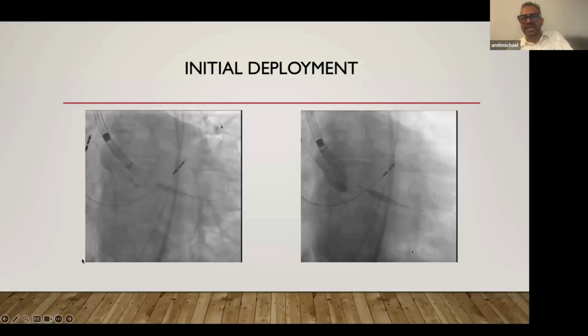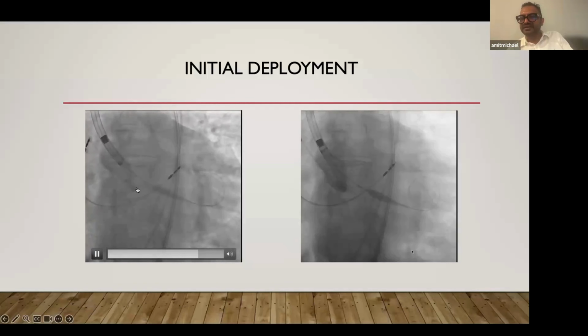So your aim for the depth has to be around 3 to 5 millimeter from this pigtail base. Okay, so this marker, as long as it's between 3 to 5 from the base, that's a good depth. You don't want anything deeper than that.